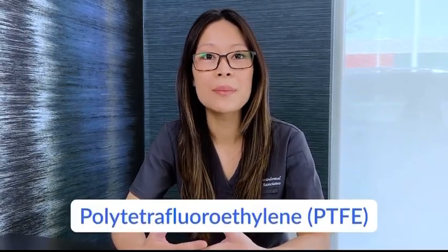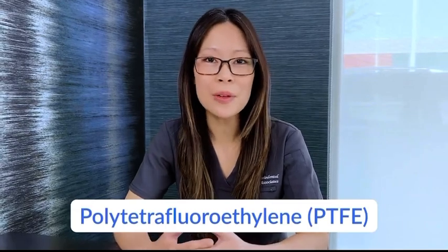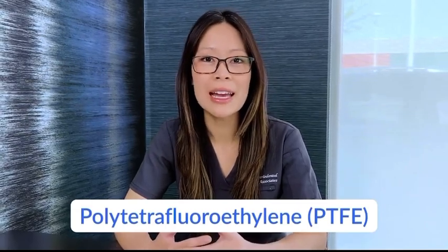polytetrafluoroethylene, PTFE for short, which is easier to handle and it stretches as the tissue heals without loosening. Silk is also a non-absorbable suture, but it's no longer a common thread due to the poor soft tissue reaction around it. The main disadvantage to using a non-absorbable thread is that chair time increases, as you must recall the patient to remove the suture. This may also cause a little bit of patient discomfort.